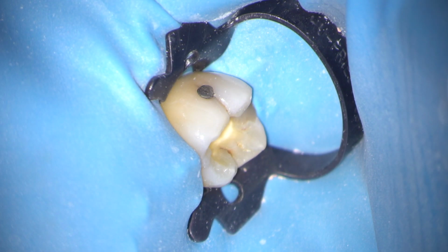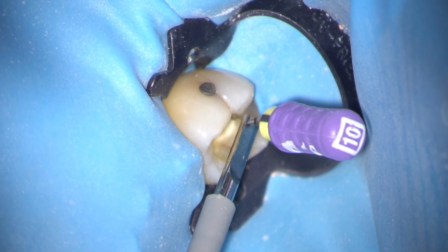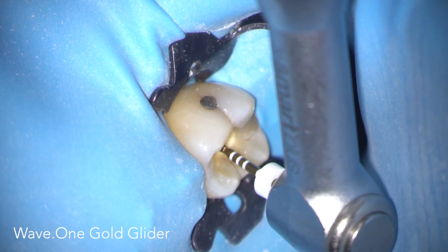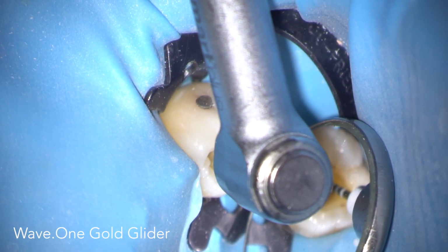We're jumping in a little bit into the preparation sequence. I've already cut an access cavity and removed most of the GP using a Gates Glidden number 2, and now I'm using the electronic apex locator to confirm the lengths of the distal canals. With a glide path already established to a size 10 flexor file, I can safely use the Wave.One Gold glider, small and primary instruments to rapidly taper the root canals.